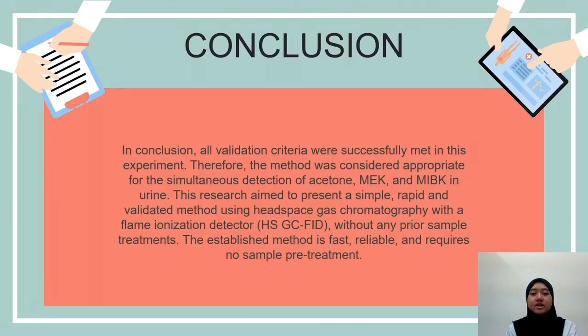Hi, my name is Ifa. So right now I'll present to you the conclusion. In short, all validation criteria in this experiment were successfully met. The method that was shown in this experiment is considered appropriate for the simultaneous detection of acetone, methyl ethyl ketone, and methyl isobutyl ketone in urine.